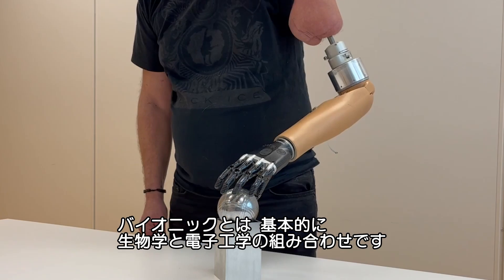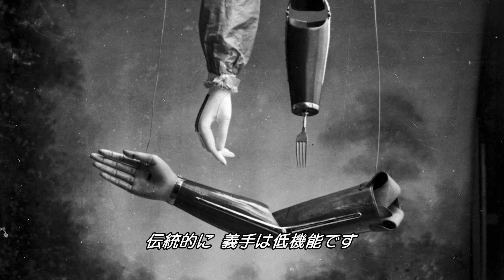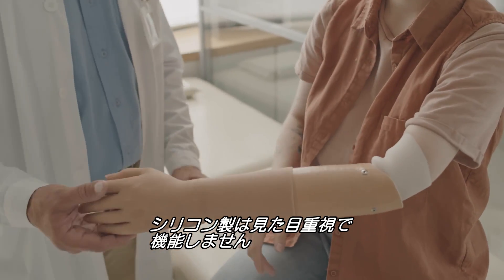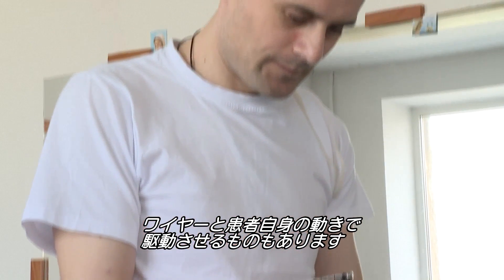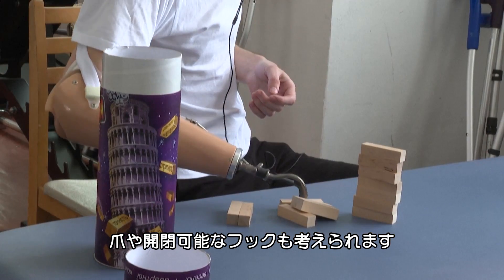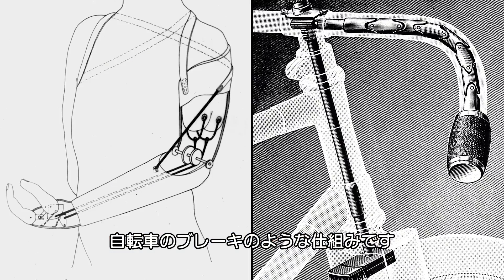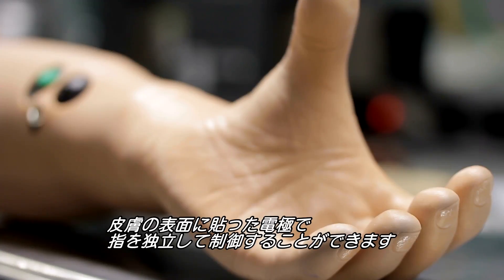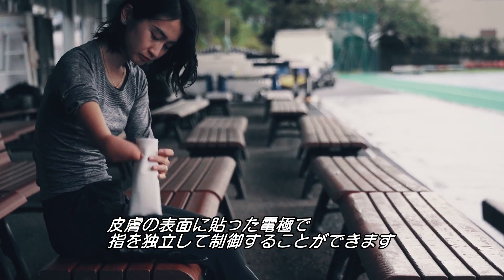Bionic basically means a combination between biology and electronics. But traditionally, prosthetic arms are pretty lo-fi. Some are purely aesthetic, made in silicone, but not functional. Then there are functional mechanical ones, powered by a wire and the patient's own movements — like a claw or hook that can open and close with a gear system like bicycle brakes. Then you have fancy electric prostheses, where a patient can control the fingers independently via electrodes placed on the surface of the skin.